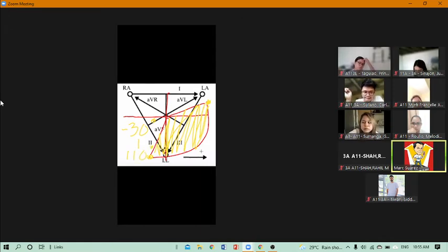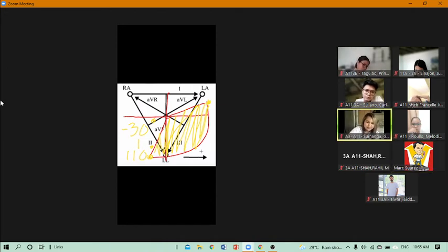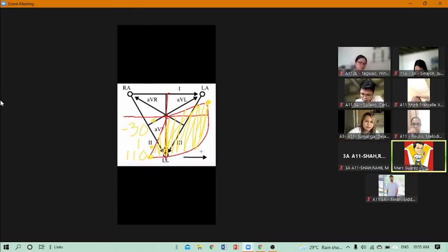So when I ask you what is the normal axis of the heart, or where is the PMI or apex beat generally located, your answer will be: if it falls within negative 30 to 110 degree position, it is considered normal.